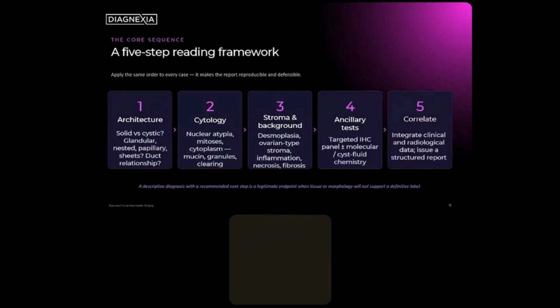But hopefully I'll be able to show you some of the features that will help in some of the images that I'll show you. But at this juncture, let me say that the stroma that is associated with an infiltrating pancreatic cancer generally isn't as inflamed as the one you would see in chronic pancreatitis because of the different etiologies.